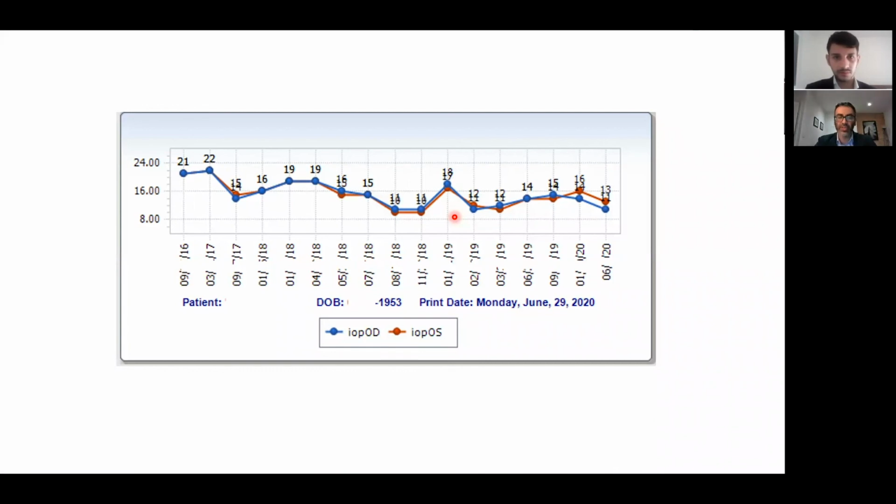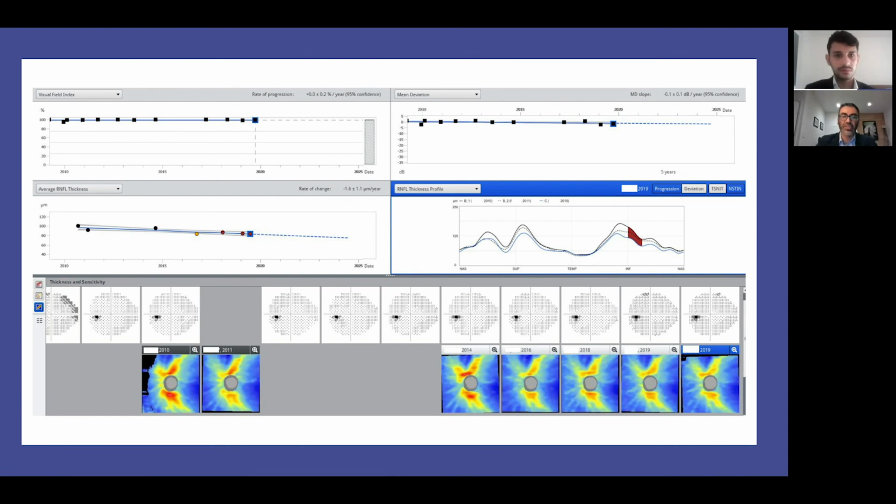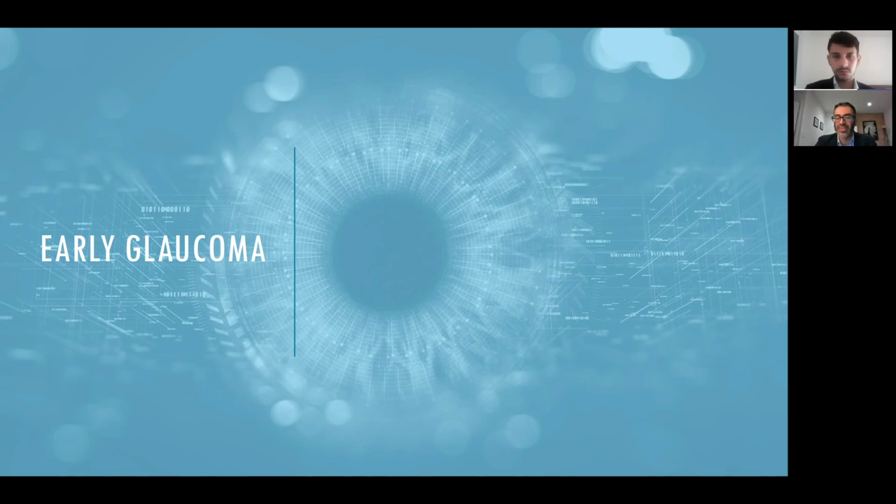Exactly. So in this particular patient, as you can see, we started medications around 2017. So you're absolutely right. We can actually re-baseline this patient. And in Size4, I kind of cut off that top area, but there's a button that you can click on for adding drops. You can put the date on when you started the eye drop, and that would actually tell you where the drops were, and then you can reassess this area. So since starting the drops, have things been pretty stable? This allows me to check that since I started this patient on eye drops, has the patient progressed? So that's a very, very good point.